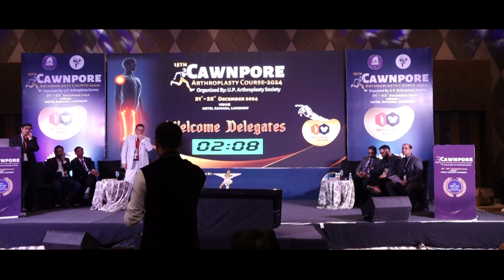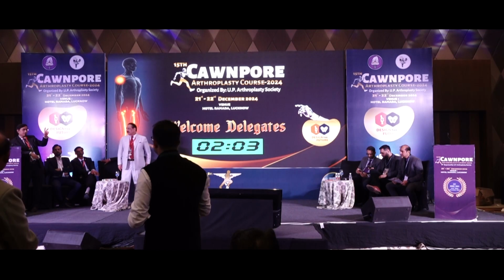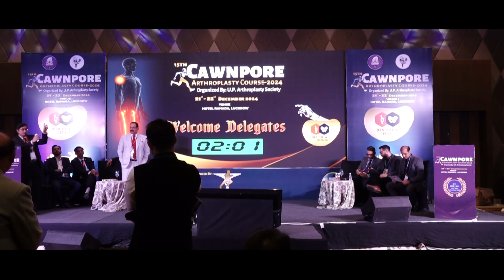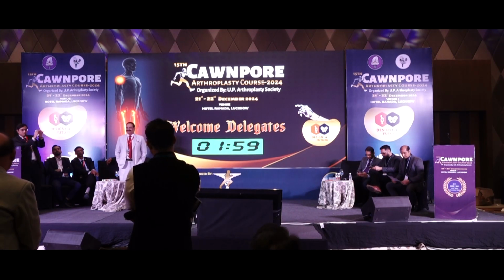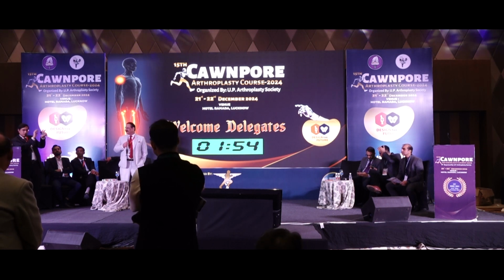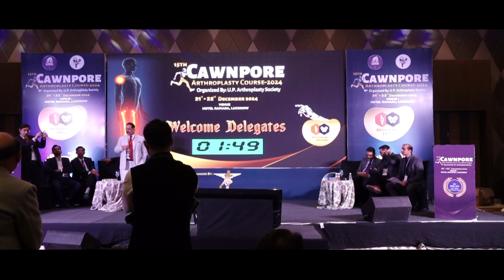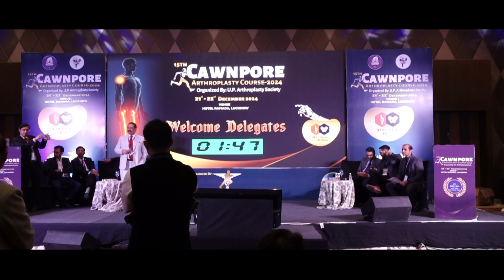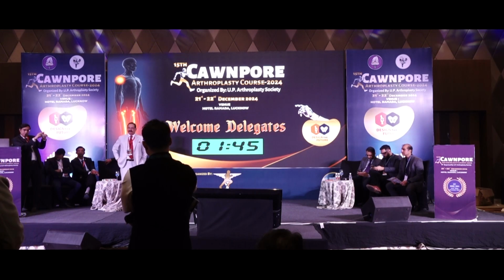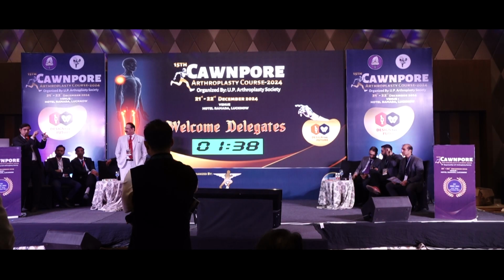In the first scenario, if you have a big defect like this oval defect, anterior-posterior fine, but medially it's sort of an oval defect, you put the augment there provisionally with two screws, with the trial in. Then you can do a reaming also, just like I showed with the femoral head. You can ream also to have good fixation there. Once the screws are not very tight, then you put in the real cup, tighten and fix the cup, and fix the screws in the augment also.